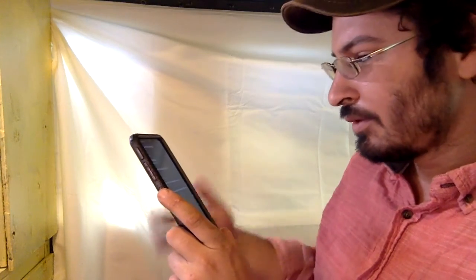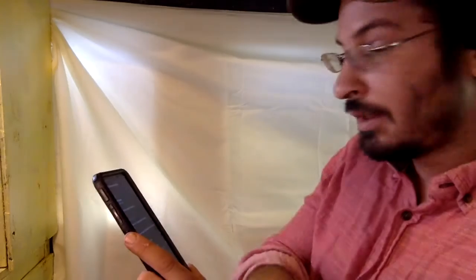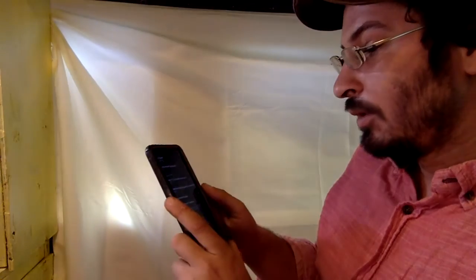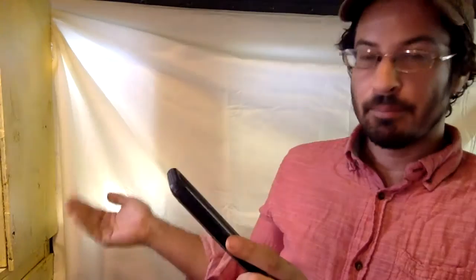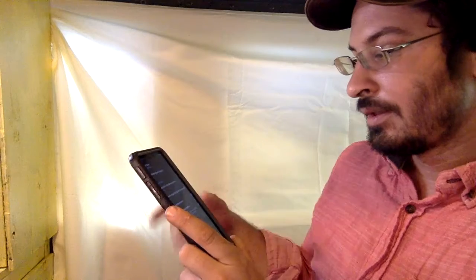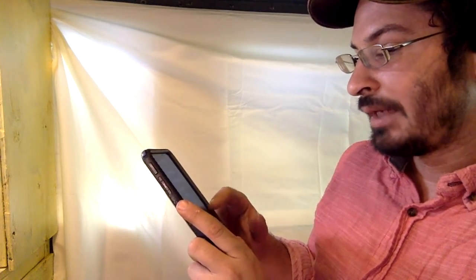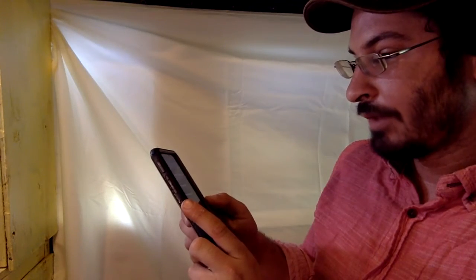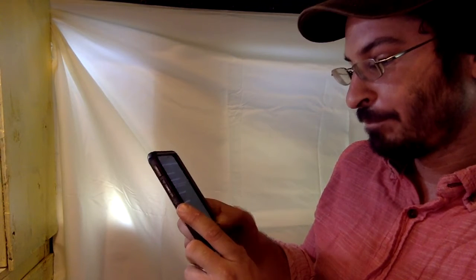Loop, is the loop on? There's the loop setting here. I'm in OpenAPS AMA. So maximum units per hour a temp basal can be sent to. That's your pump has to have the maximum the same as this app. And then the maximum basal IOB OpenAPS can deliver. AutoSense, which is a thing that you can research.